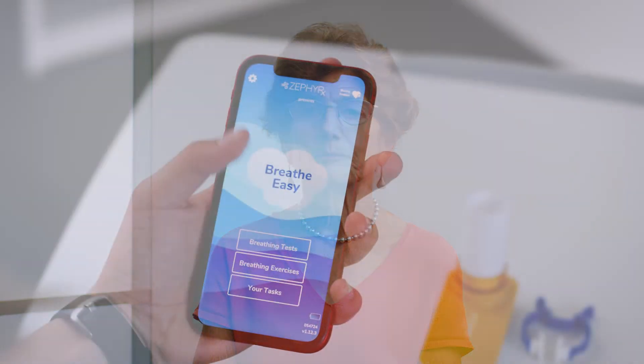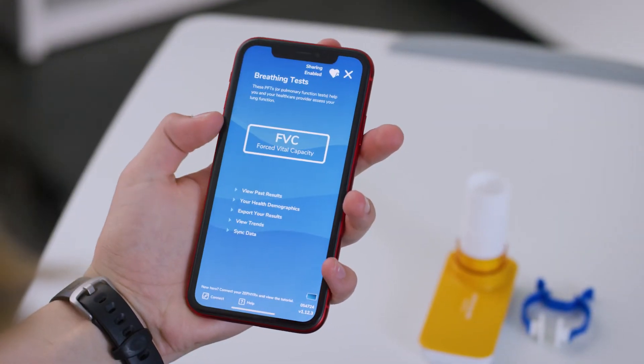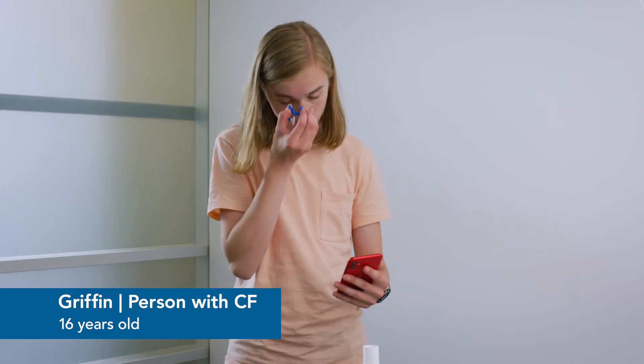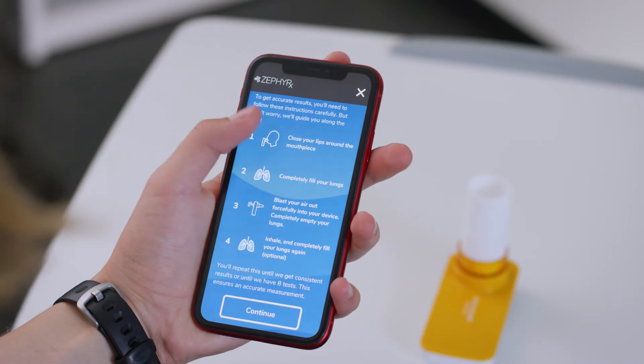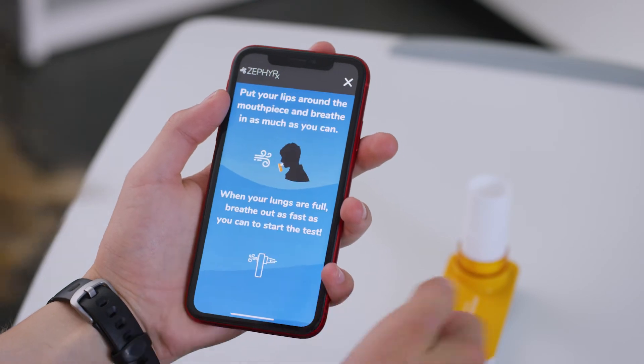Now, let's see what an actual test looks like. Put on your nose clips. Click FVC, then click Continue.